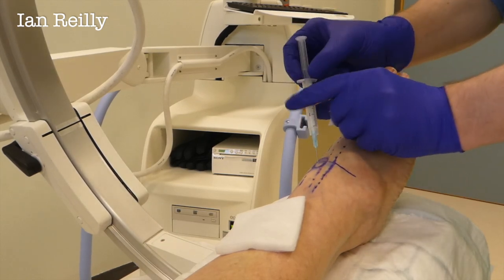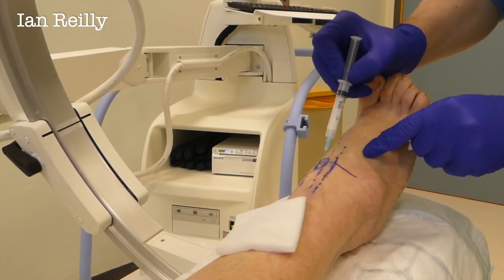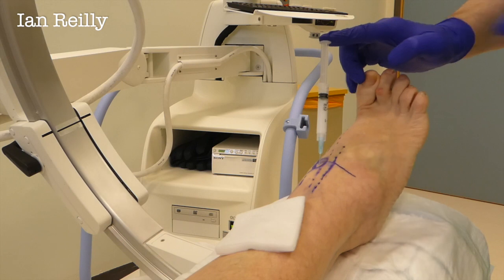Yes — and that's just kind of where we want it to be. I'm going to do a last x-ray.